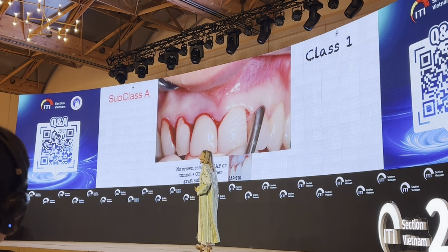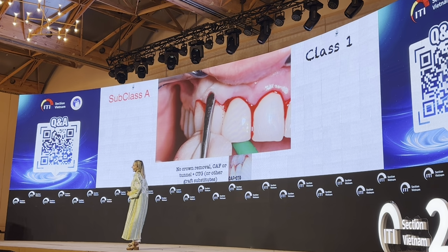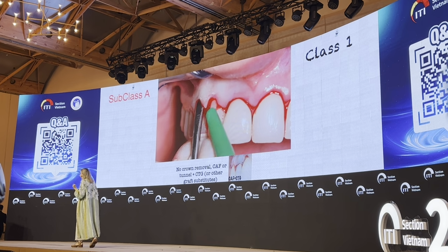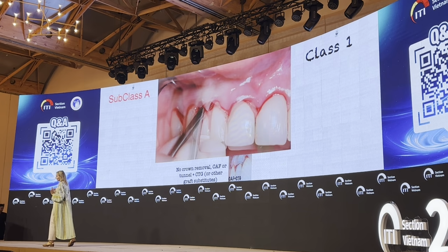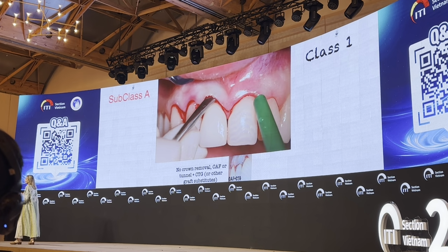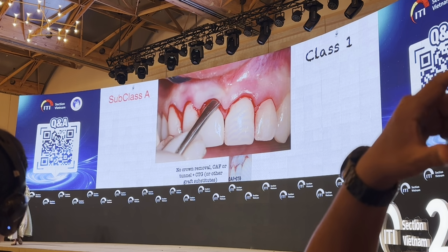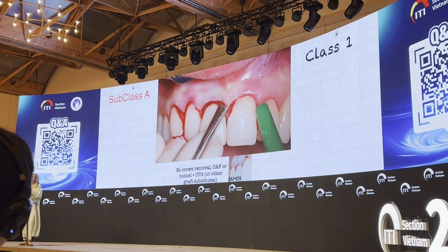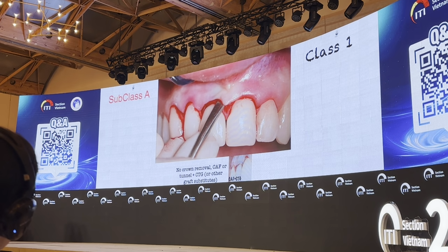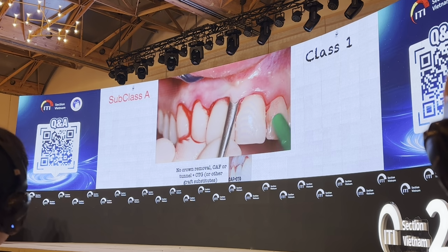But why am I not going to make a tunnel in that case? As I was saying before, if I end up with a less than ideal result, it's going to be a nightmare for the patient. And this can happen, for example, if you have connective tissue graft exposure. Connective tissue graft exposure, for me, is one of the worst complications of this surgical procedure.